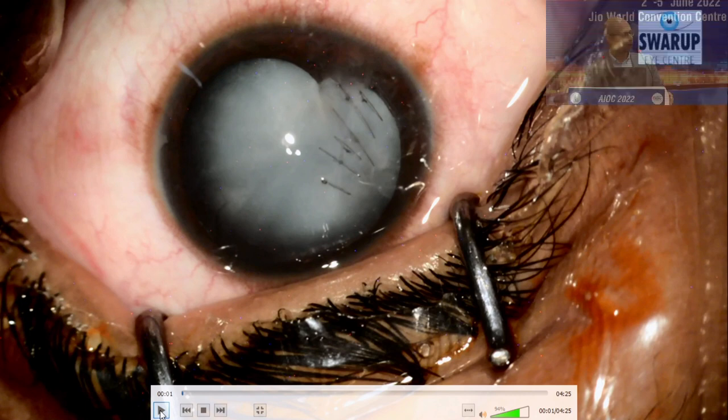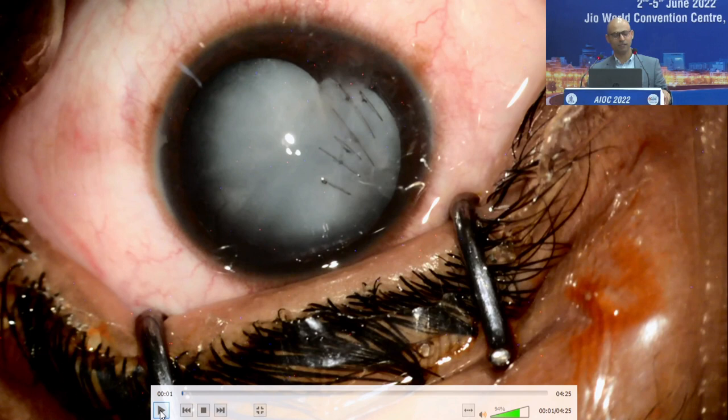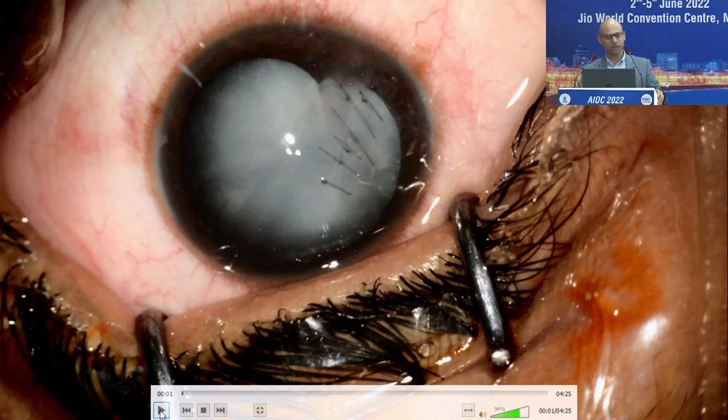So this is not a very complicated case. This patient basically had come to me after having a penetrating trauma in the eye, and the corneal tear repair was done elsewhere. The patient had come to me with a drop in vision, and when I saw him, the patient had a torn capsule and sutured corneal wound like that, and there was cortex coming out, and it was an intumescent lens. In the inferior area of the tear, the lens matter was basically in contact with the cornea, so I wasn't sure if we had vitreous in the wound also.